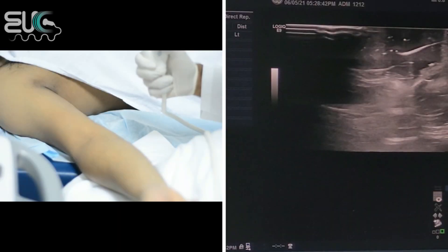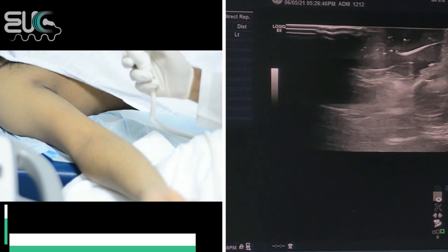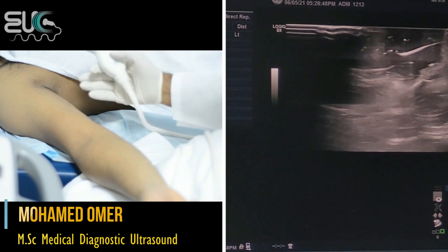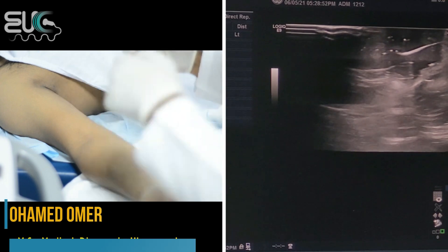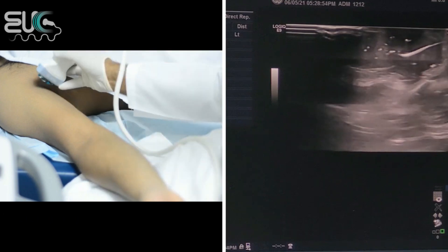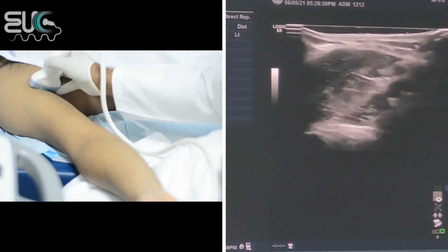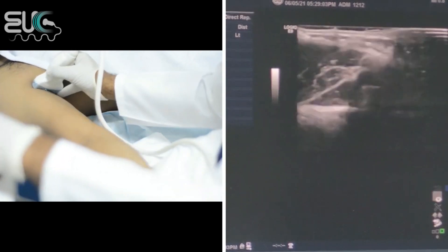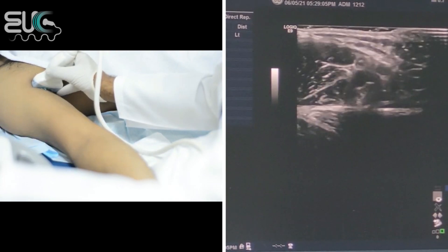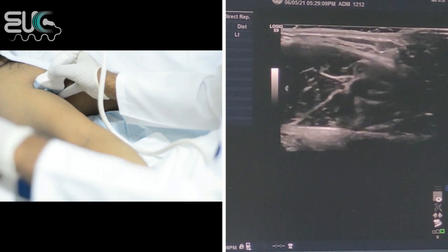I'm going to start with the highest frequency probe at 15 MHz because our volunteer today has good anatomy. For the upper arterial study, I will start by scanning the axillary artery. I will reduce the frequency until I have good penetration, so I will make it 10.